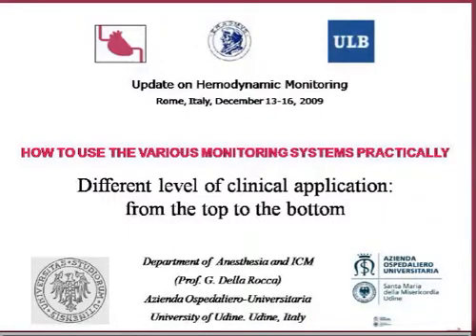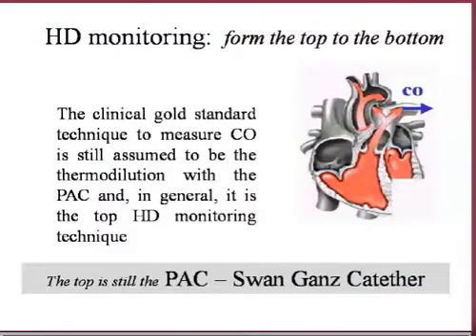My presentation today will be very easy because I have to recap in a very easy way what you should do every day in your practice. With this slide, I'm sure I will make Jean-Louis Vincent happy, because the Swan-Ganz catheter is still considered the standard technique to measure cardiac output. Of course, I think everybody agrees with it.